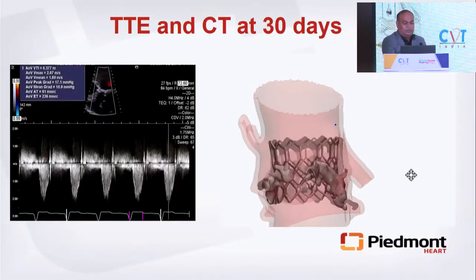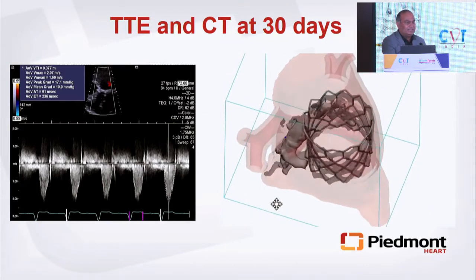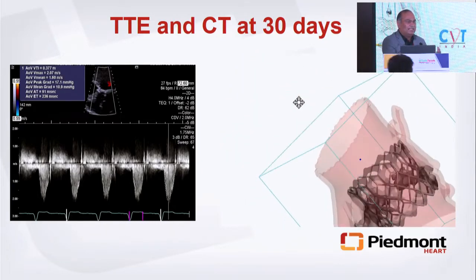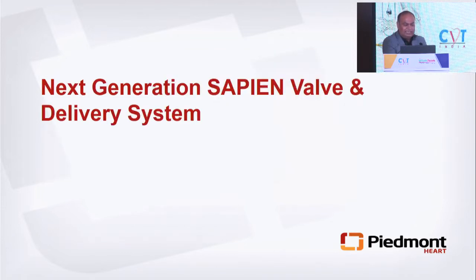Intra-op TE, very good, just a mild or trace PVL. Mean gradient was a little bit high, which actually came down to around 10 millimeters at 30 days. And the CT shows exactly what we had predicted. The calcium will move all to the left side, but not puncture the sinuses. So calcium, you can deal with. This is what I grew up with, and I'm sure everybody here has seen this. You can deal with your enemy, but at least respect, prepare, plan. And like Dr. Severs was saying earlier, we interventionalists sometimes get arrogant, like, yes, I can do anything and everything, but just take a moment to respect and be prepared.